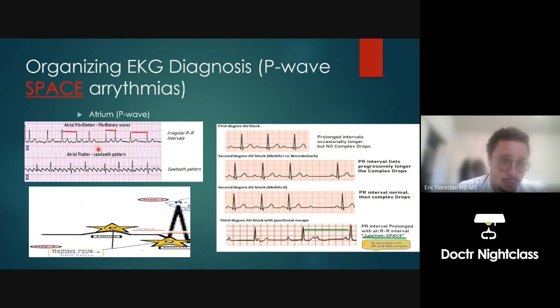Great. Now the other flavor. These are very distinctive, but they look alike. How do you distinguish these? We know here that the RR intervals are normal, and they're pretty much the same in length. Now we look at the P and the Q. So the rhythm, we see that our P is all messed up. This feature is called sawtooth. It looks like teeth, right? Someone's gonna bite into a New York bagel. I want a New York bagel. Sawtooth pattern.